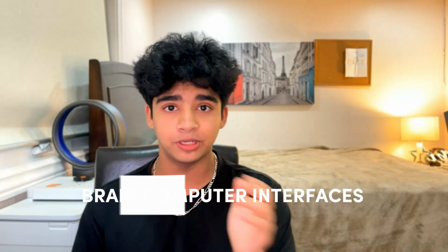While this model is training, I want to elaborate a little bit on why this is important in the first place. Well, in the world of brain-computer interfaces, classification is one of the major steps that allow for magic like this to happen.